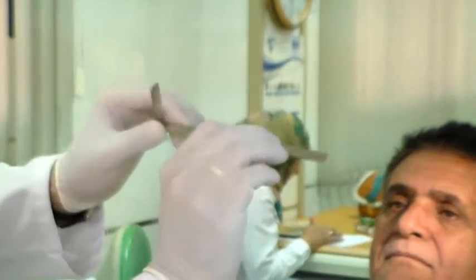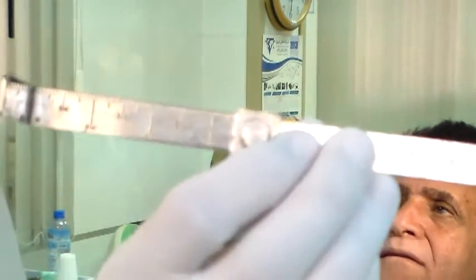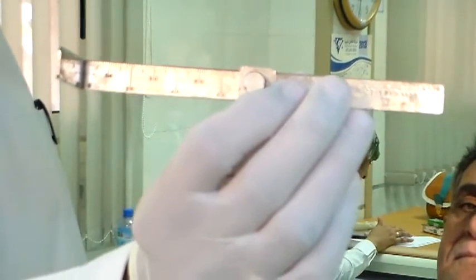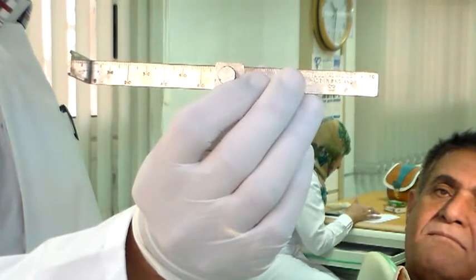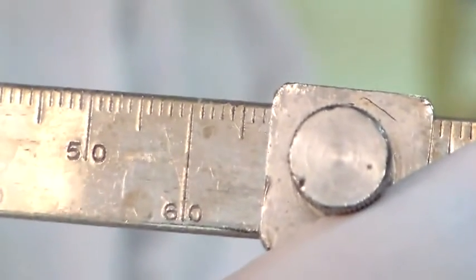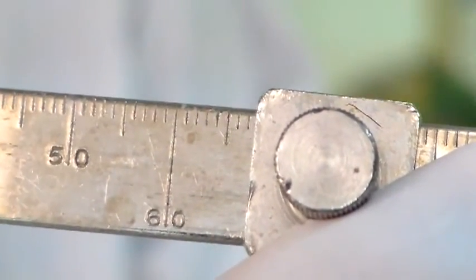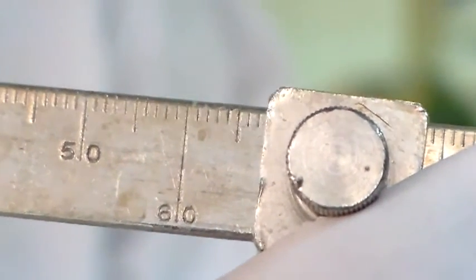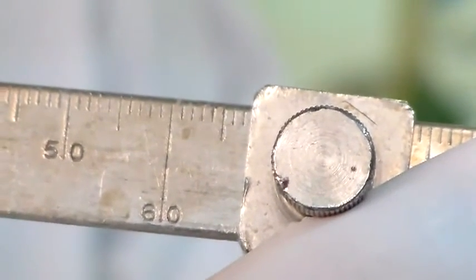So the reading shows 67, 68. So you can see the reading now is at 67, 68. You want to turn around the flipper and see? Just turn the flipper. Okay?